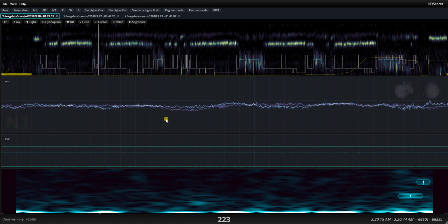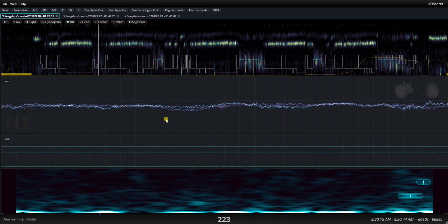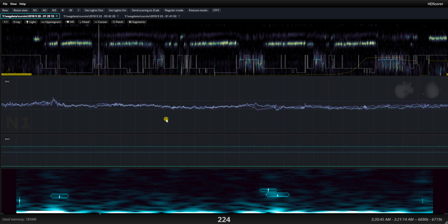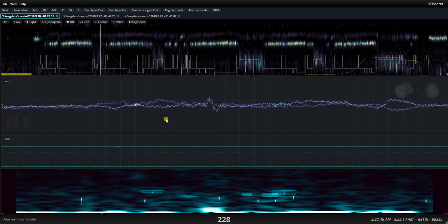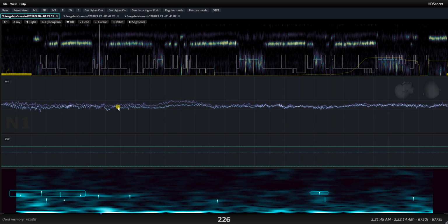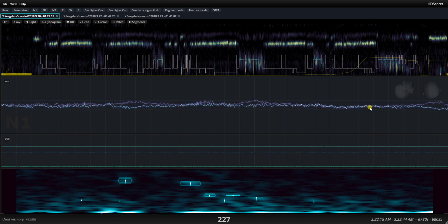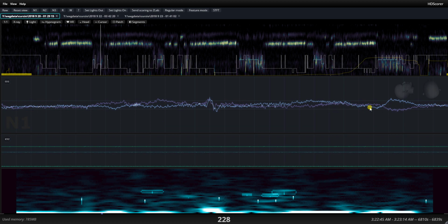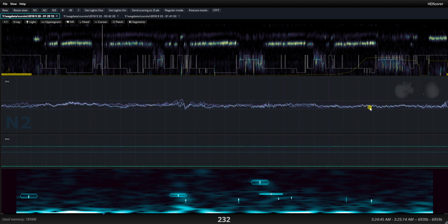This is interesting because there's sometimes cases in which there are eye movements, but they're so mild that the algorithm doesn't catch them. And if you force it to catch them, then it's going to be very subject to false positives. So I'd rather not. But yeah, I do kind of see the evidence of slow rolling eye movements. There are K complexes which could indicate arousal as opposed to being characteristic of N2 sleep. So I think that's fine. And here we go back into N2 sleep.